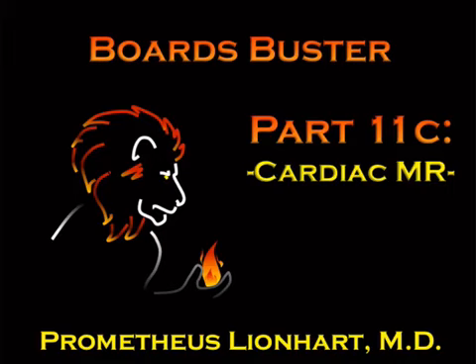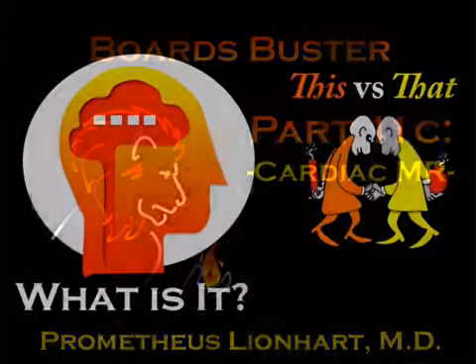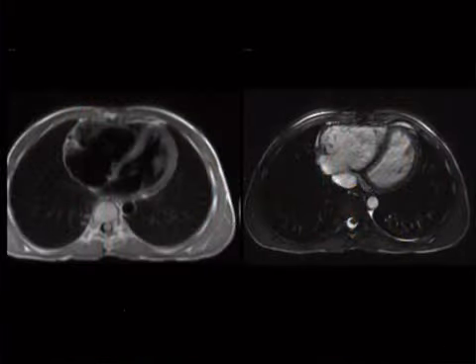But let's be honest, cardiologists are the only ones that really do it, and that's the way it's headed. But it's still on the boards, so we still have to know it. So let's start off with some physics, just some basic sequencing here. There's three main sequences that are done with cardiac MR, and these are two of them. I'll talk about the next one in the next case.